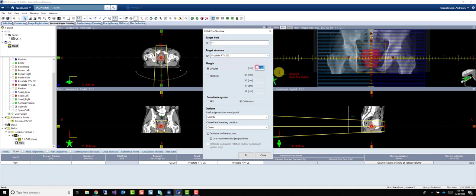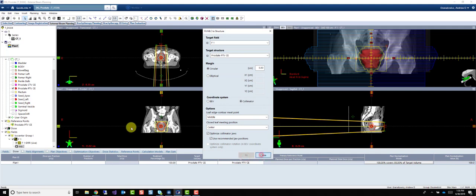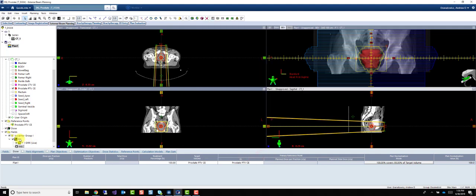For this case we're going to use a five millimeter margin around our PTV.